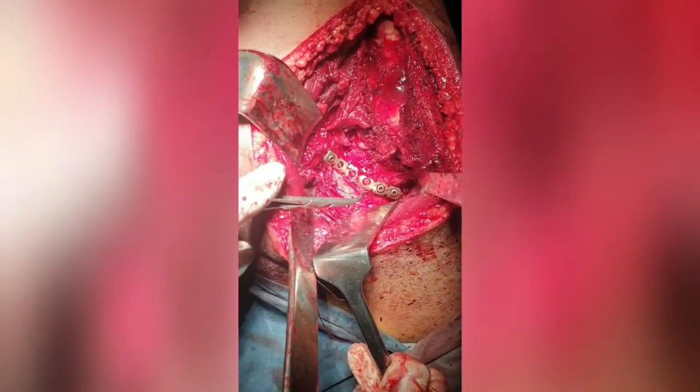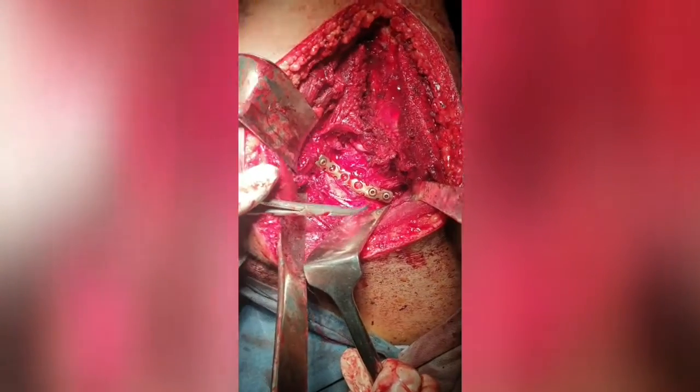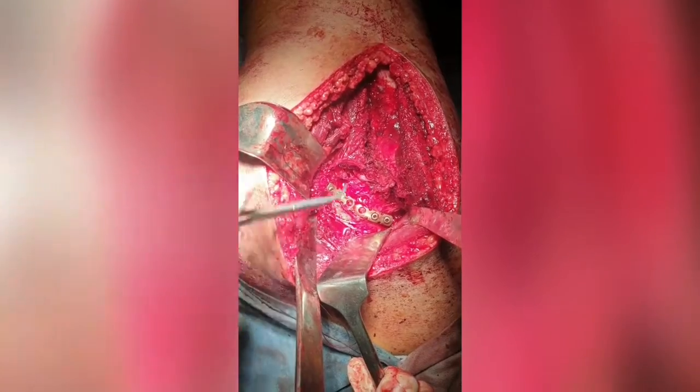See, so completely stable now. So this is our final construct.